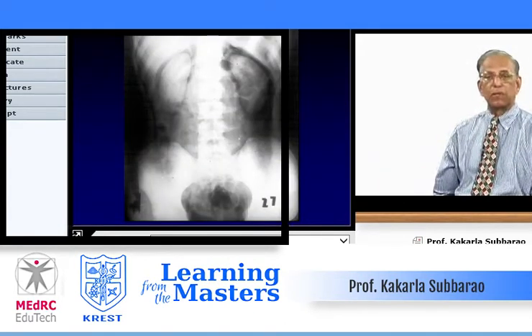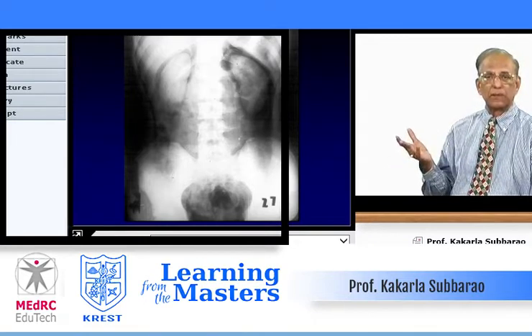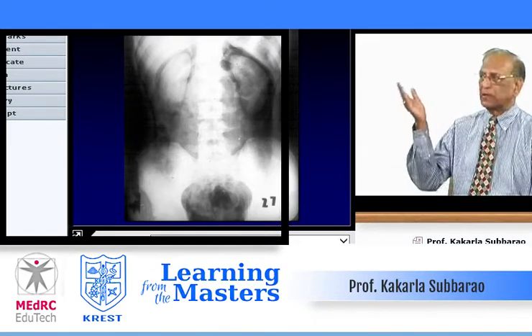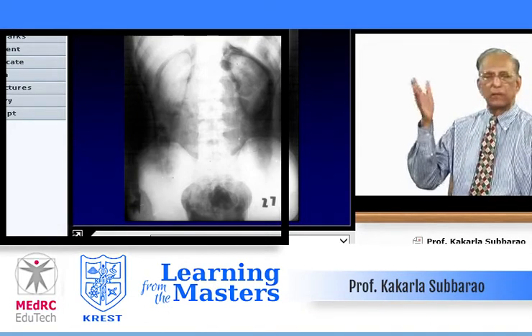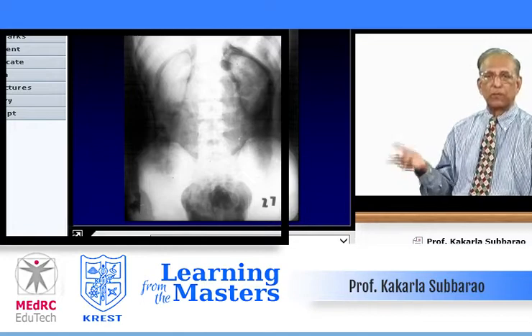The perforation may be, for example, posterior duodenal ulcers, maybe retroperitoneal, and then gas goes along the kidneys, outlining along the psoas shadows. It is the perforation retroperitoneally of a duodenal ulcer.